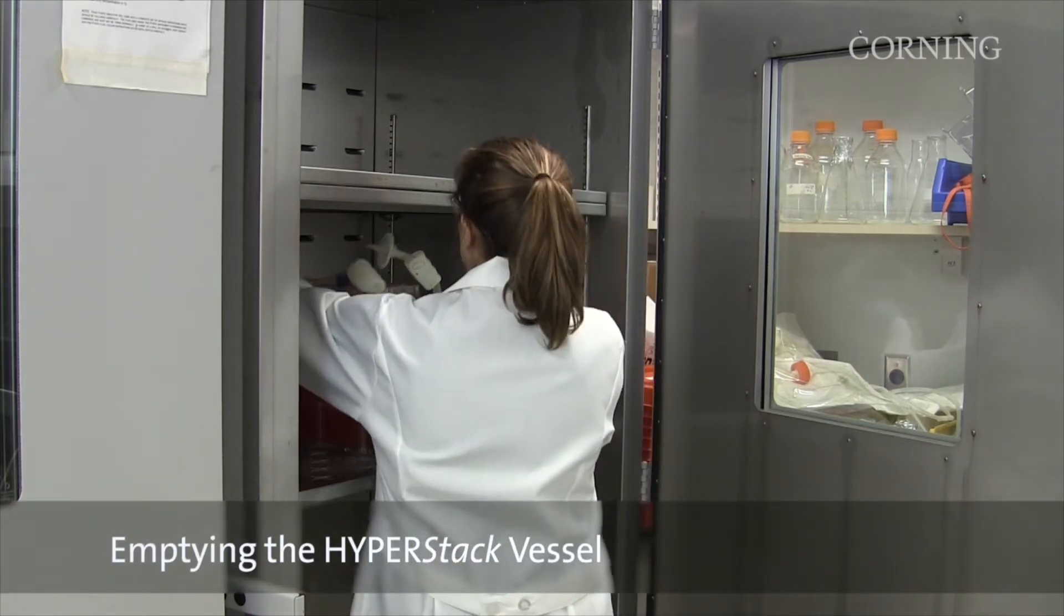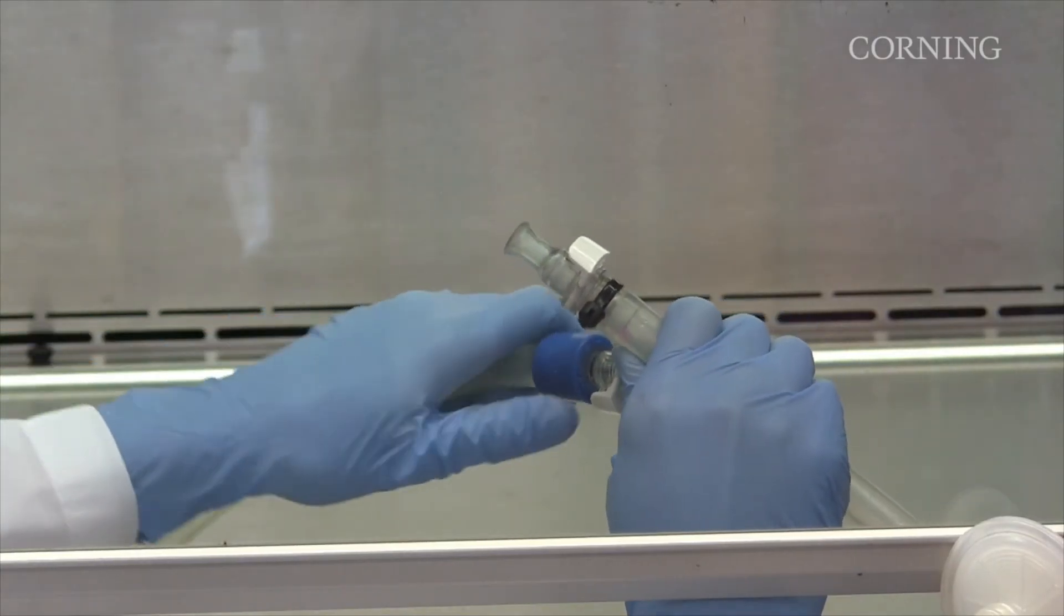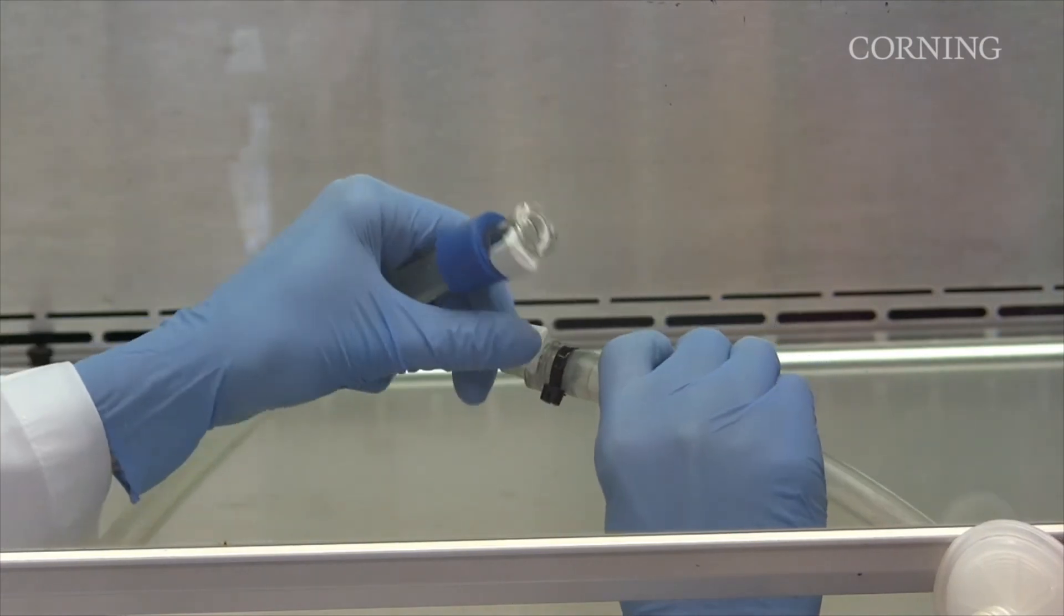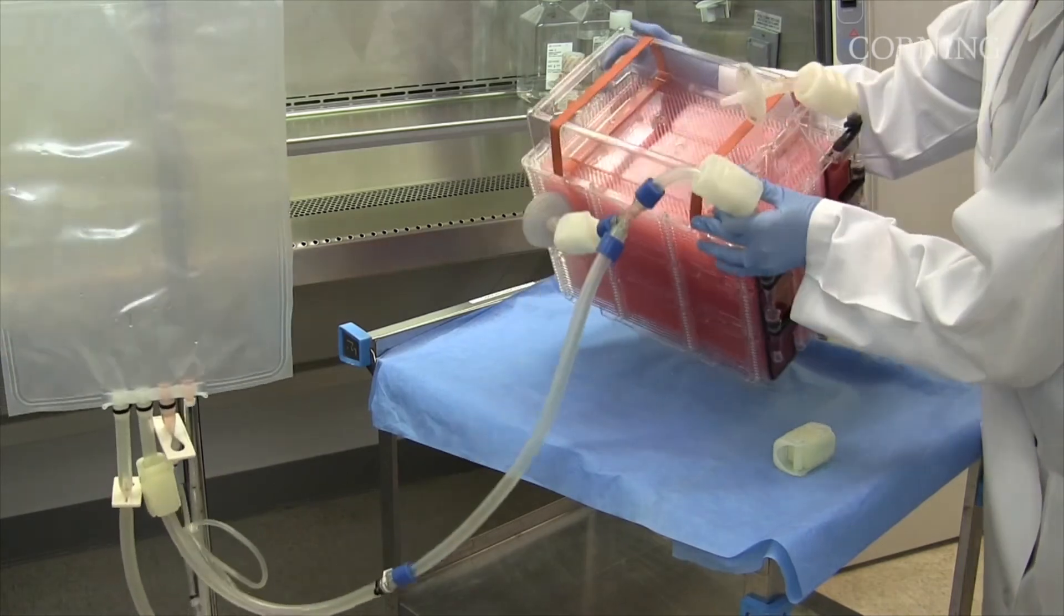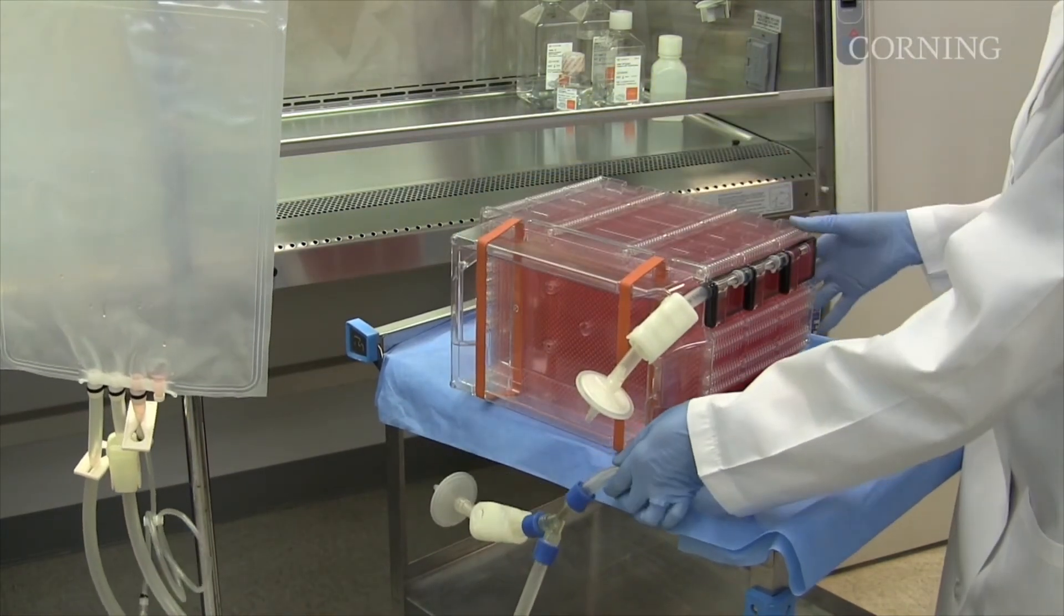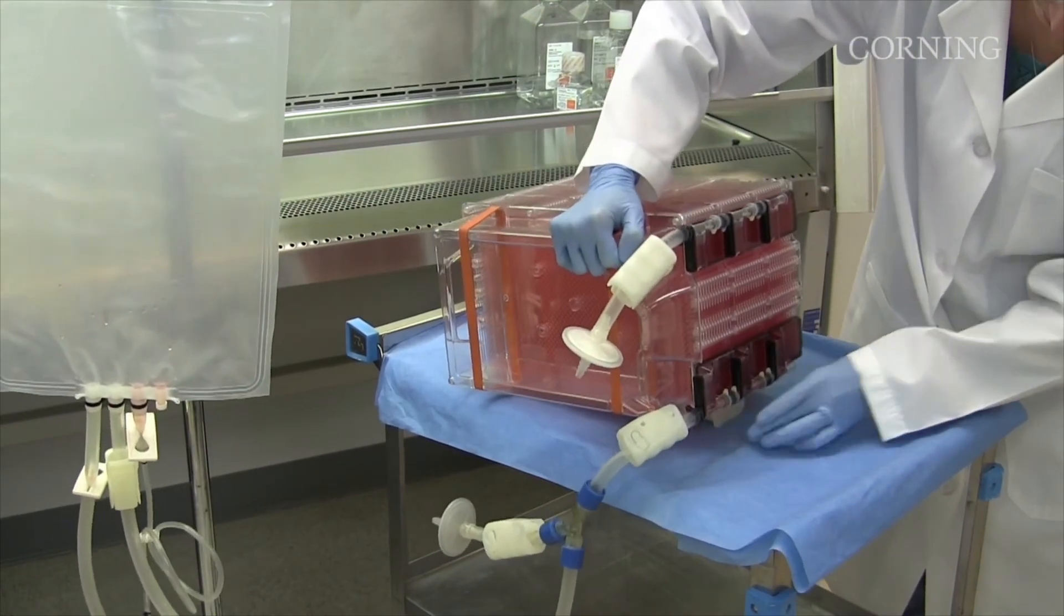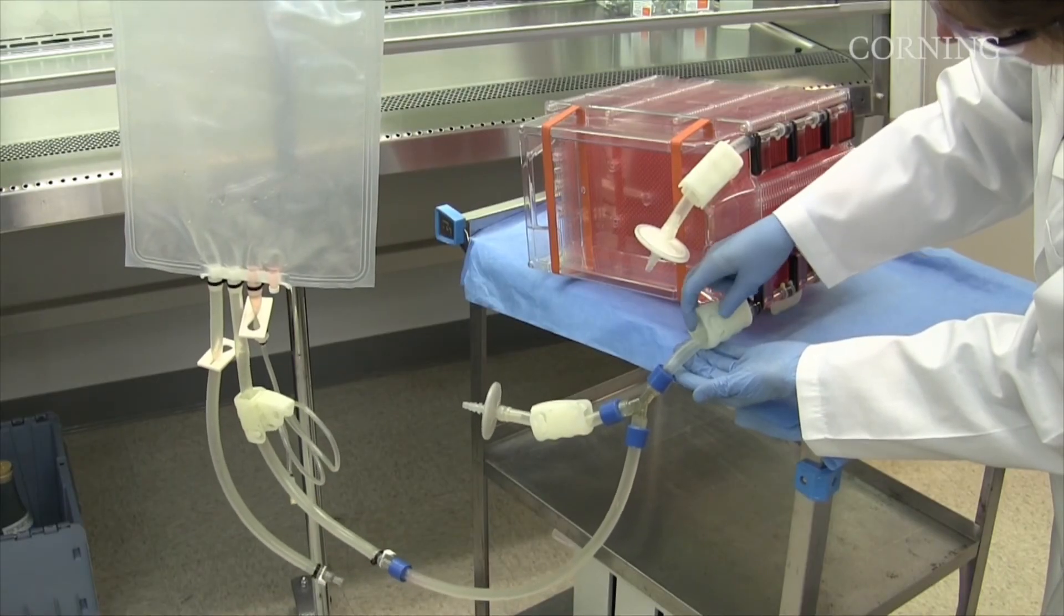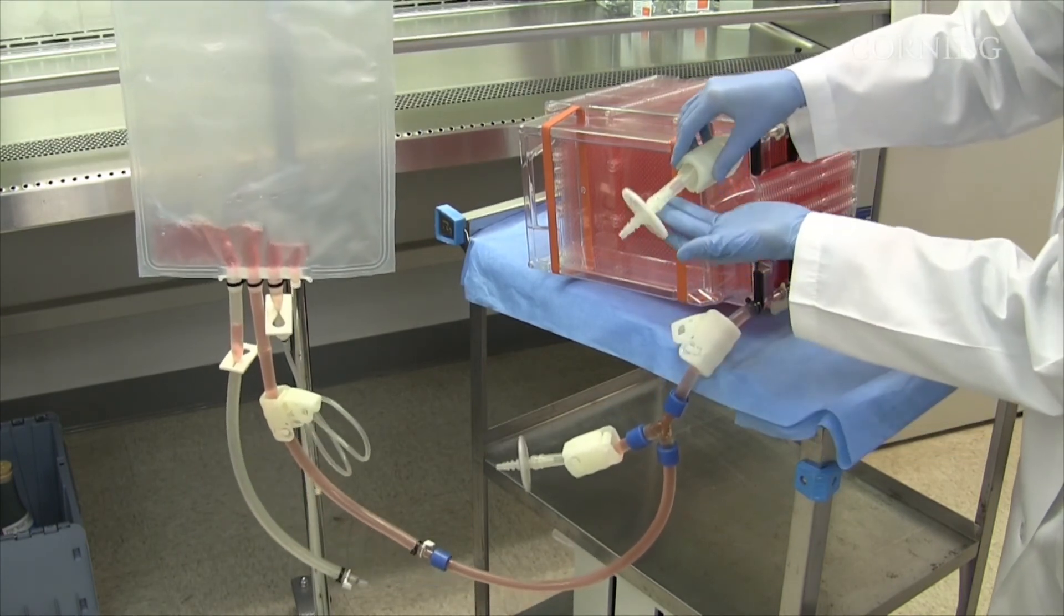Remove the HyperStack vessel from the incubator. Aseptically connect the liquid handling tubing via MPC quick connects or welding to a collection vessel. Place the HyperStack vessel in the fill position with the collection vessel lower than the height of the HyperStack vessel.